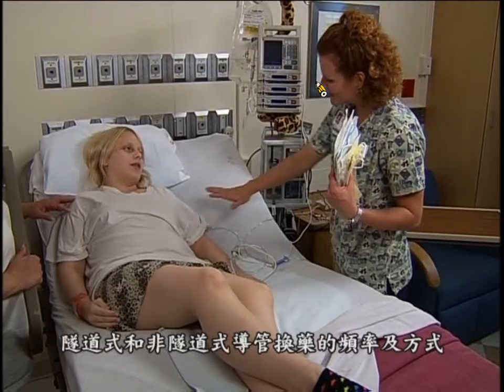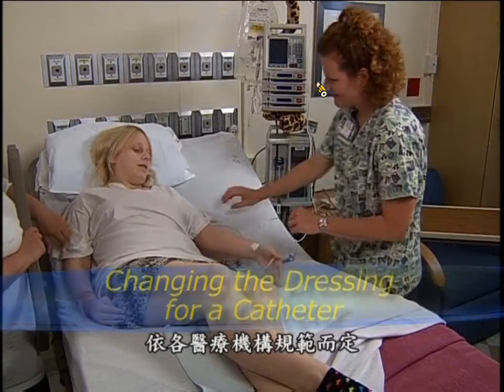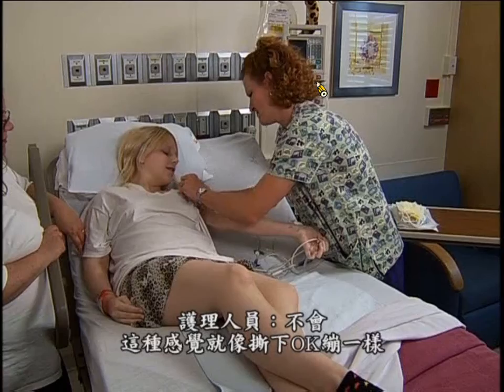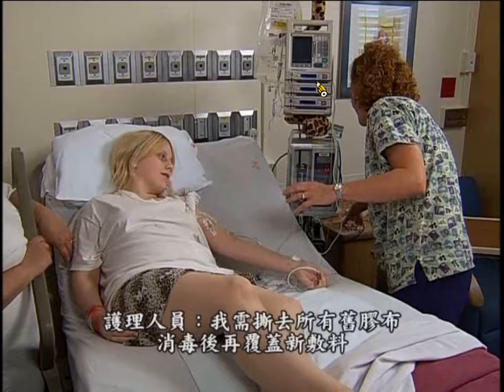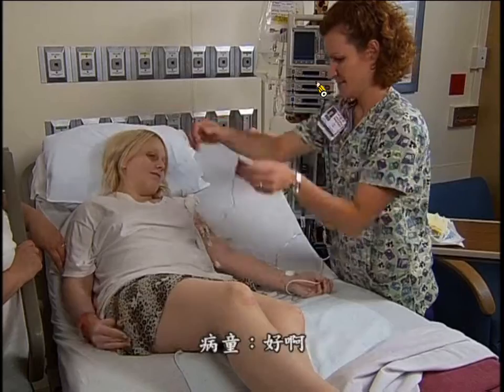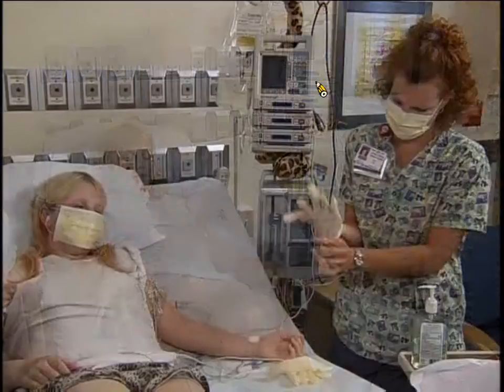Whenever you need to change the dressing on a tunneled line or non-tunneled catheter, follow facility policy on the frequency and type of dressing changes. It's just going to feel like a Band-Aid coming off. I've got to pull off all that tape and clean it, put a new one back on. If you want to, why don't you listen to your iPod while I'm doing it? Okay. You can use this hand while I start getting my stuff together.